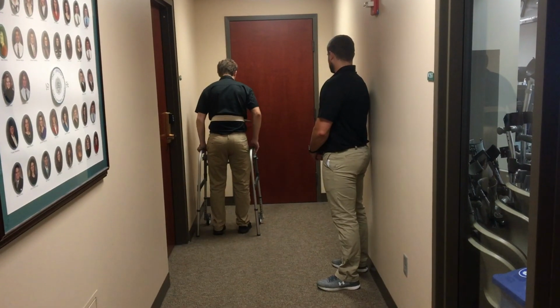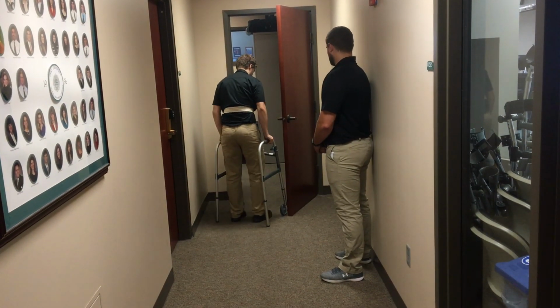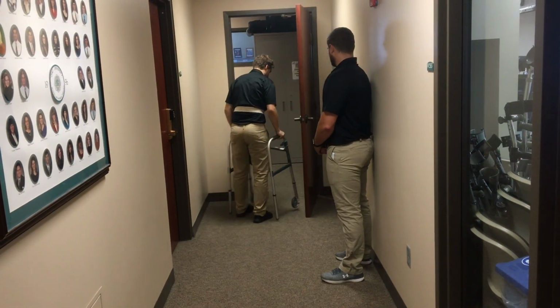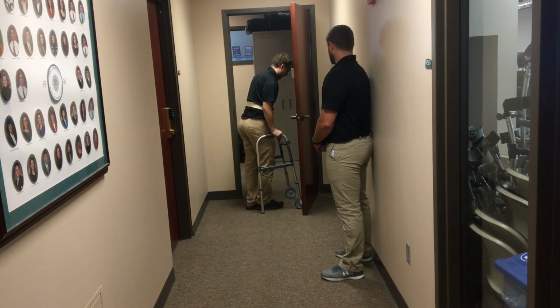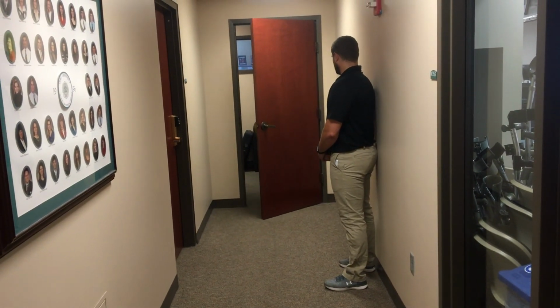Instruct the patient to approach the door as before, on the handle side of the door, outside of the door swing arc. The patient will then shift their weight to the hand opposite of the door handle and use the unweighted hand to swing the door wider than the walker and the patient. The patient will then quickly return their hand to the walker and move the walker into the open door, with the legs closest to the door serving as doorstops. The patient will then step into the walker and turn the walker sideways into the doorway. The patient can push the door further open if needed. Then they will slowly ambulate sideways through the doorway, using the legs as doorstops, until the patient is completely through the door.